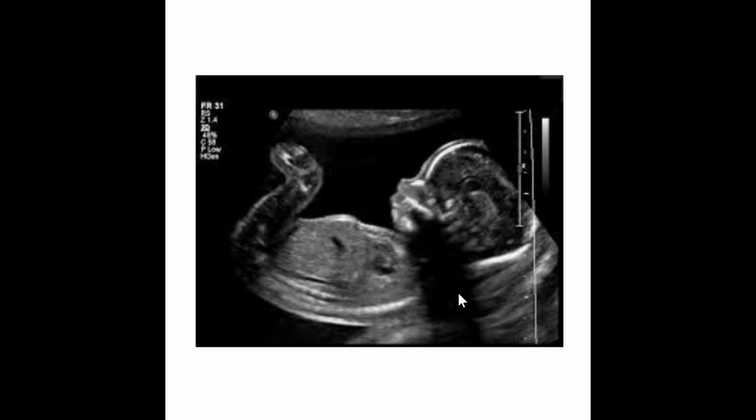Now, if you see shadowing in your picture and you need to work around it, trying a different angle, trying a different window is probably your best bet. Sometimes you can use your TGCs to brighten this up and maybe get a little bit more information from that area. But typically, if you have a very, very strong attenuating structure, you're probably not going to get enough sound energy to make anything meaningful behind it.